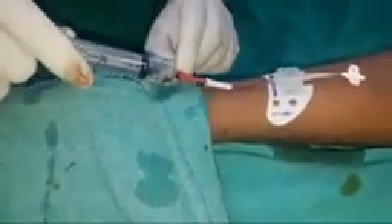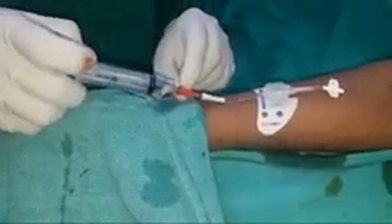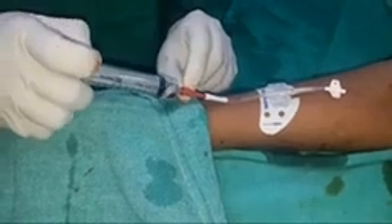The backflow of blood is confirmed, meaning we are in the correct lumen and it is patent. I am now flushing with heplock.